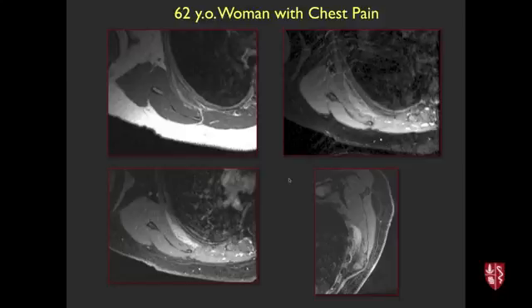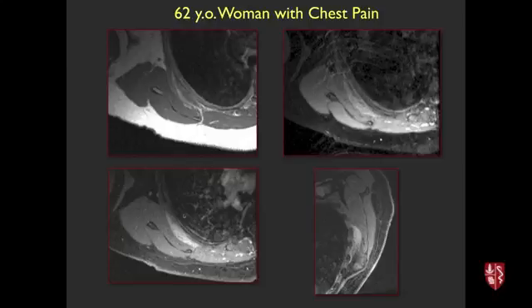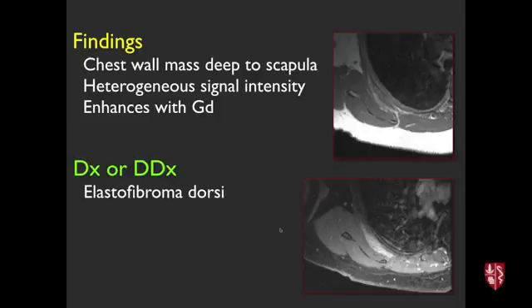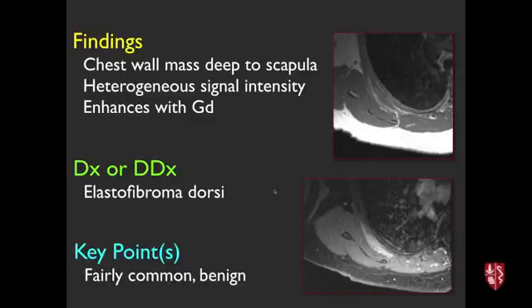Next case, 62-year-old woman with chest pain. There's a lesion deep to the scapula with contrast enhancement. This is an elastofibroma dorsi — a benign lesion, probably related to chronic friction, occurring in older female patients. It can have fatty streaks on cross-sectional imaging because of its elastin and fatty elements.